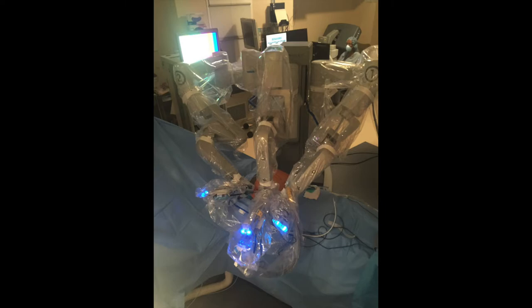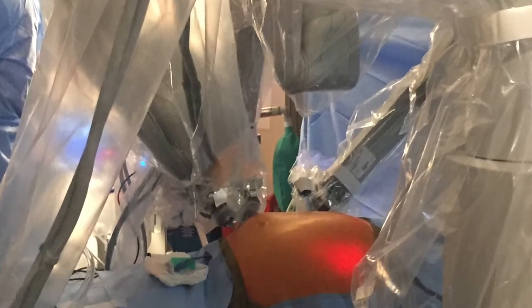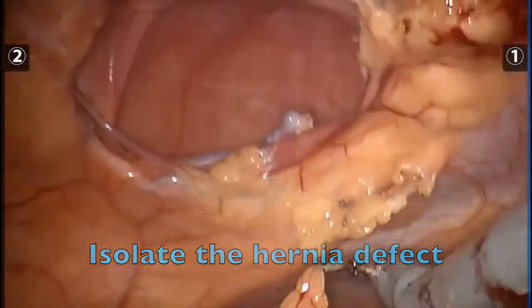The robot was docked over the contralateral abdomen, again somewhat favoring the left upper quadrant. I performed lysis of adhesions to isolate the hernia defect.